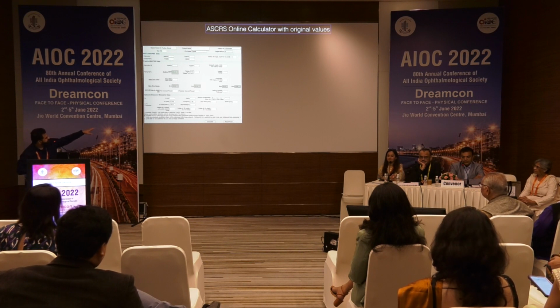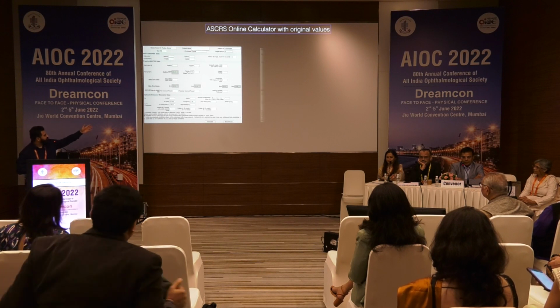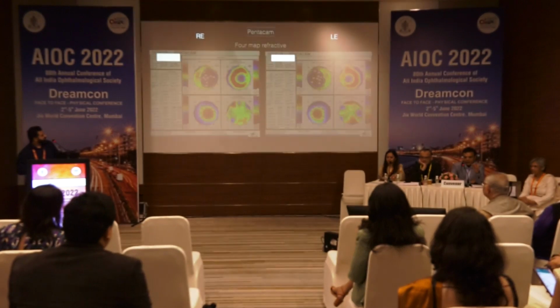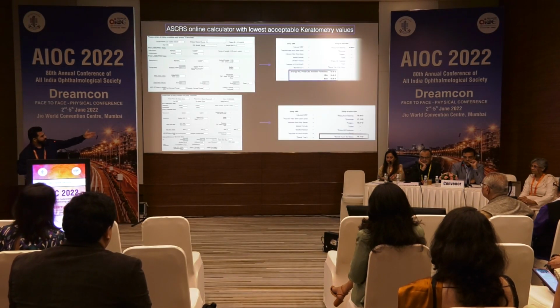The AC depth is something that I had. None of the other measurements were there. So on the ACRS, I had to basically enter 31 diopters. And this is what I got.